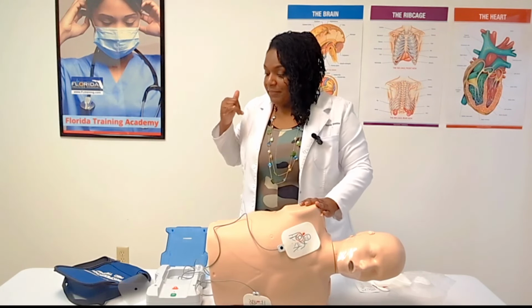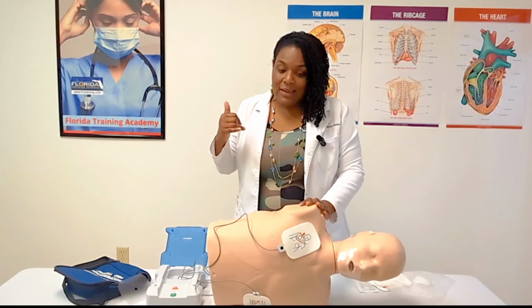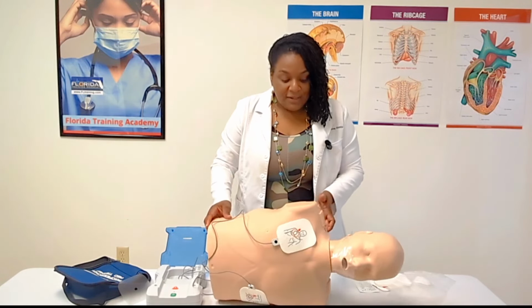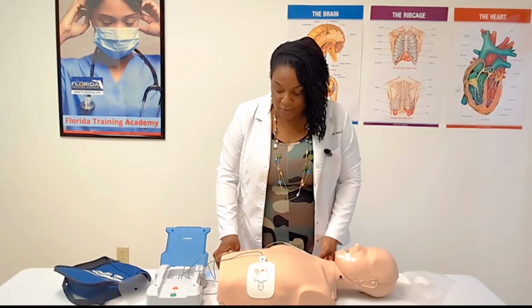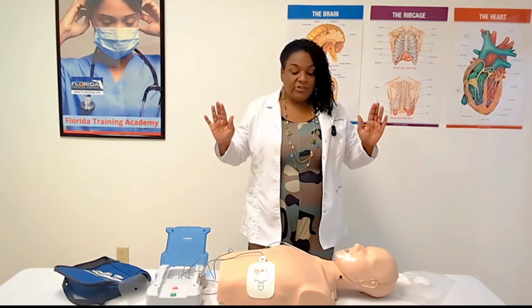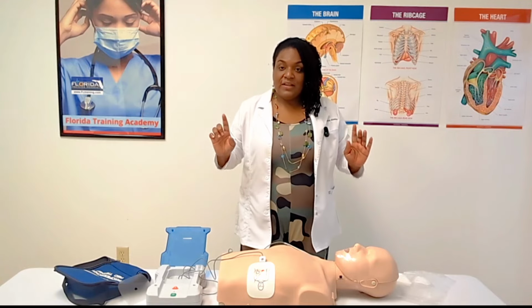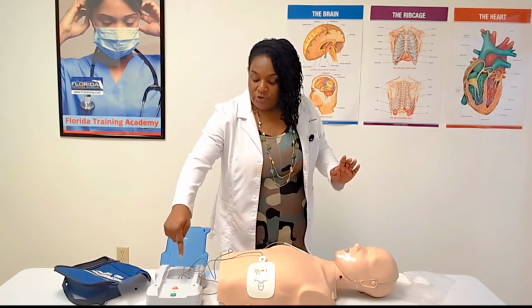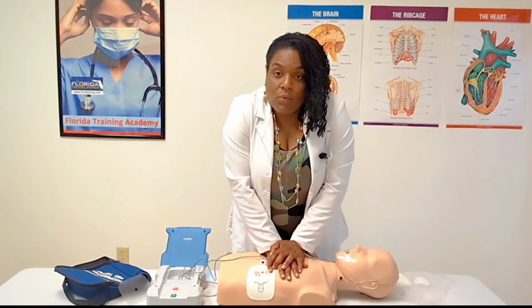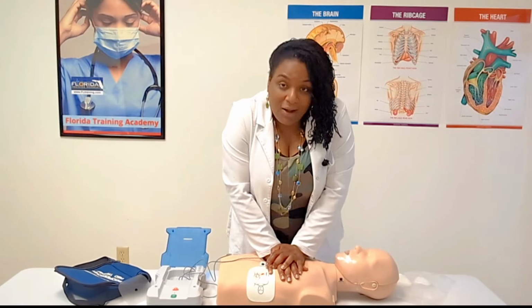However, let's say we're on the phone and we're busy with 911 and the person loses their pulse again. All you would do is lay them back onto the ground, allow the machine to analyze, make sure that you're not touching when it's analyzing, and when it says the shock is required, you would press the shock button and go right back into your high quality chest compressions and CPR.